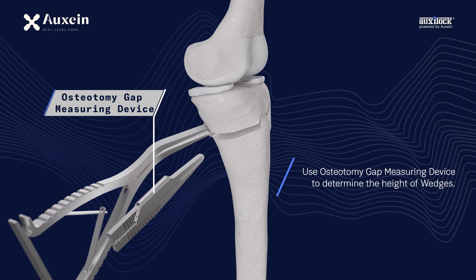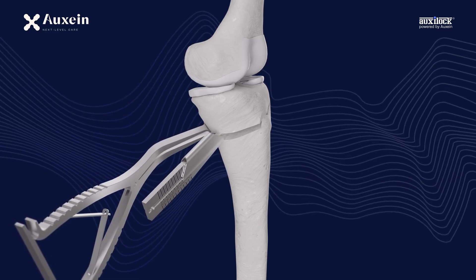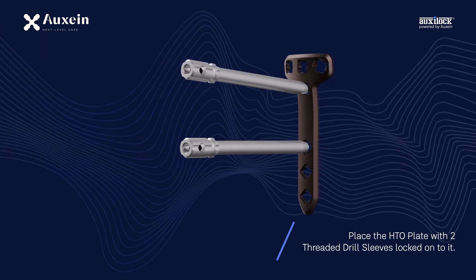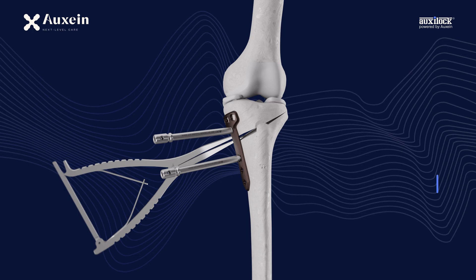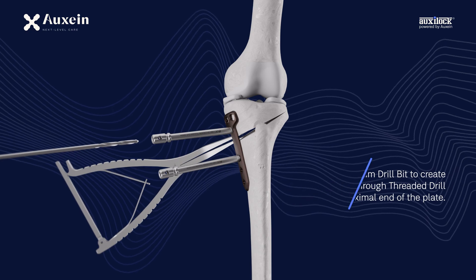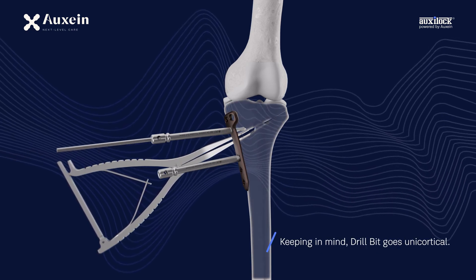Use the osteotomy gap measuring device to determine the height of wedges. Place the HTO plate with two threaded drill sleeves locked onto it. Use a 4.3 mm drill bit to create the pilot hole through the threaded drill sleeve at the proximal end of the plate, keeping in mind the drill bit goes unicortical.